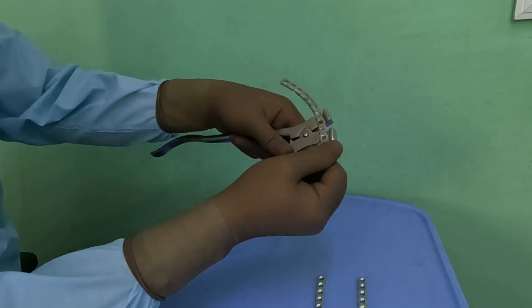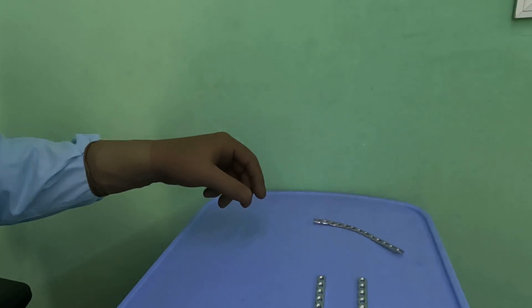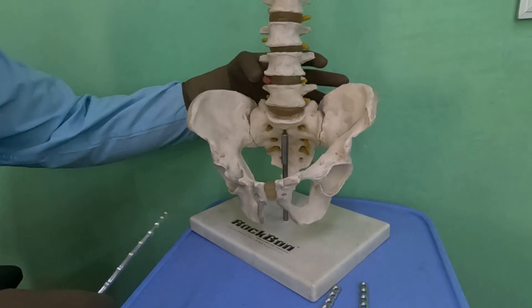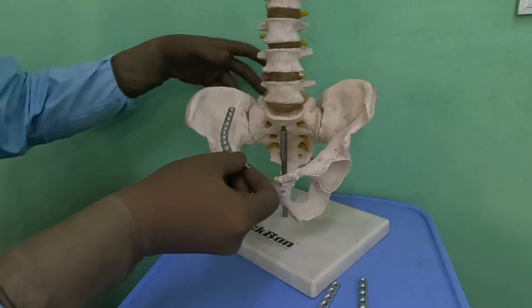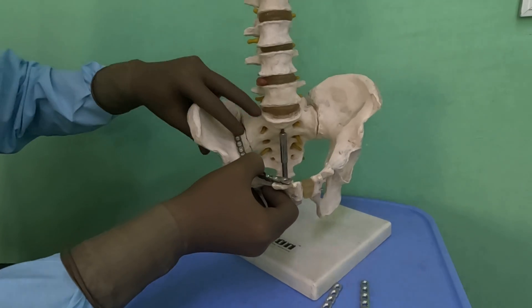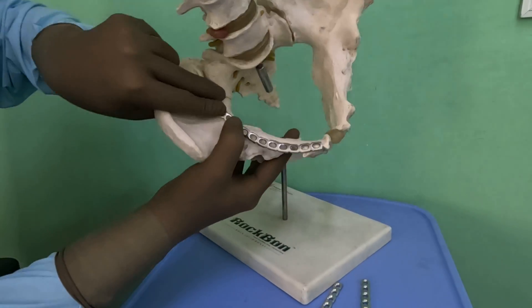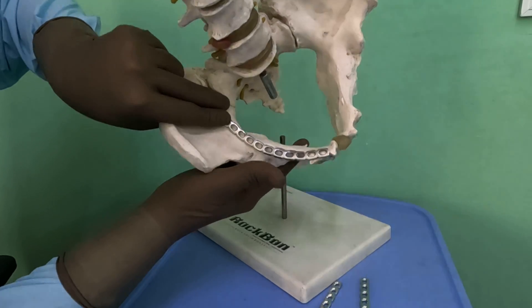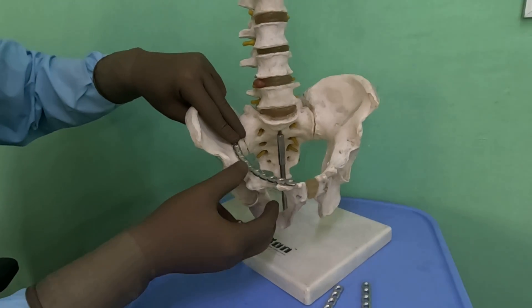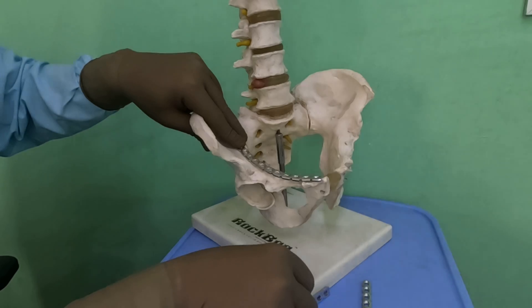Let us put it on the pelvis and see whether the contour is appropriate or needs further adjustment. I am using a model of the pelvis to demonstrate. We have contoured this plate for the right side and you can see it is beautifully sitting. Looking at it from the top, it is almost the right contour. The rule is that if you take a plate and bend it halfway through, you will almost get the correct J shape. The only issue is it is standing out slightly here, which might need a bit more contouring.